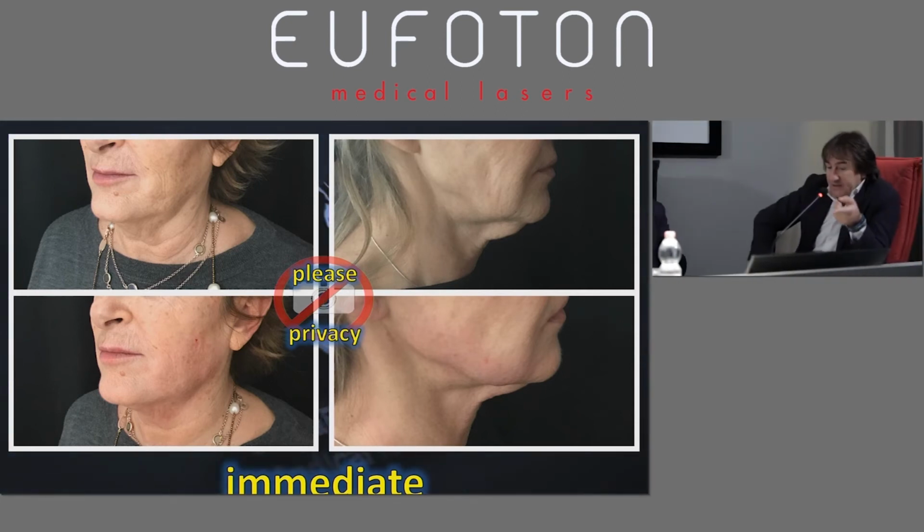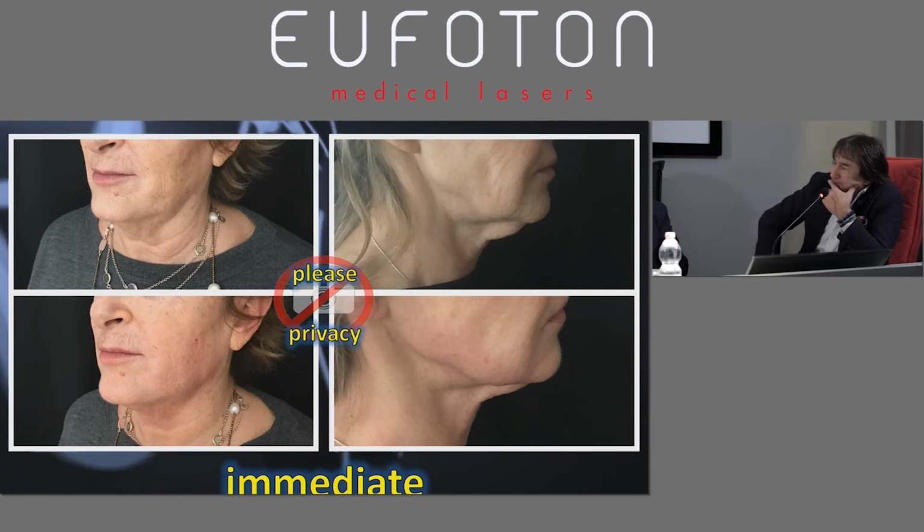As to the buccal angle, you reach the mandibular ligament. I trespass this ligament with the fiber. I go up to the median line sometimes. That's quite a difficult area. We have to pay attention and be careful. When I go through this region, I use a retrograde and not an anterograde approach. Not many passages, just a few, to have a sort of symmetry effect.